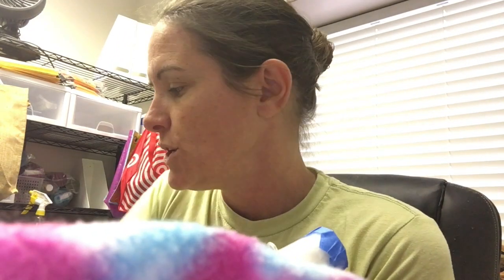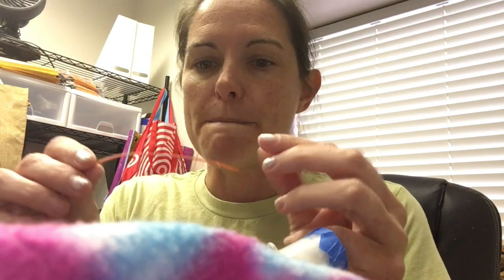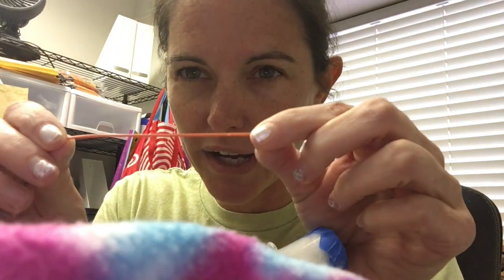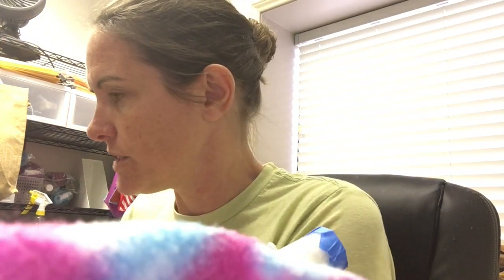Since he is safely not able to suckle a bottle without it getting into his lungs, first thing we're going to do — I got my tube here. This is just your normal catheter tube. This one is a 3.5, and as you can tell, it already has little tiny holes at the very bottom on each side. That's how the milk comes out. You do not have to cut this tube. Please do not cut the tube because it will damage as you're going down — it's going to be sharp for the little bellies.